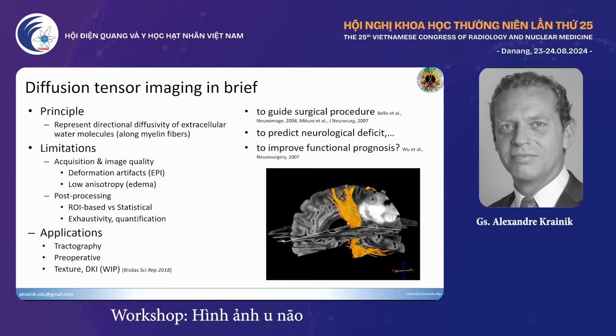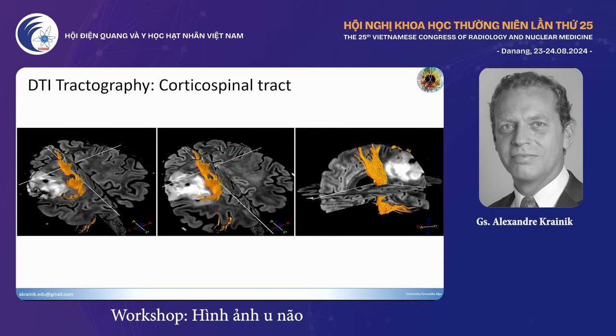Actually, it was quite fashionable during the year 2000, and neurosurgeons now are more familiar with subcortical electrical stimulation, and if it were for me or for my son or for my wife, I would prefer that they be operated on by a neurosurgeon who masters subcortical stimulation rather than tractography, because there are some weaknesses.